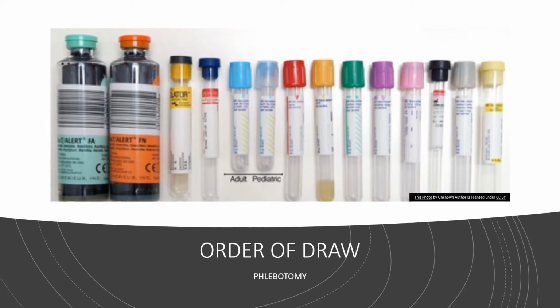a very difficult task for a lot of phlebotomists to learn the order of draw and the importance of it, and why it's so important, and all the other nuances that go along with what additives are in each tube, why we order them, why we draw them in the order that we do. So I want to do a small presentation.